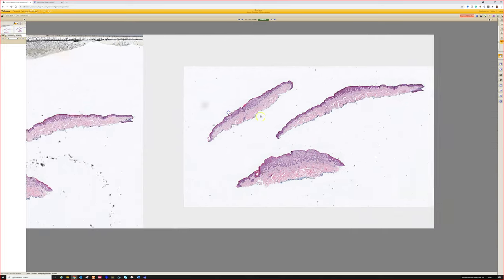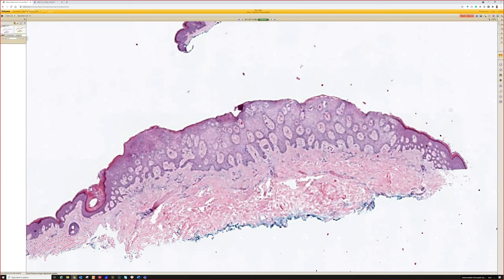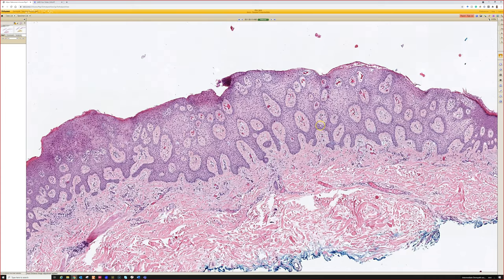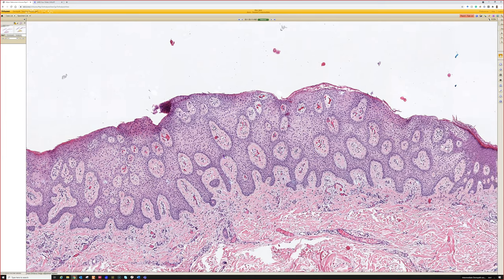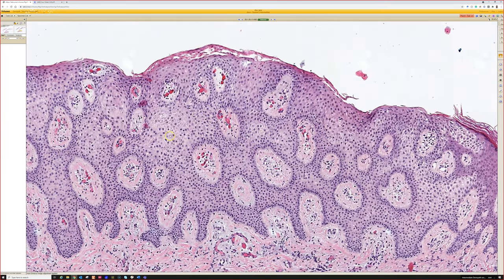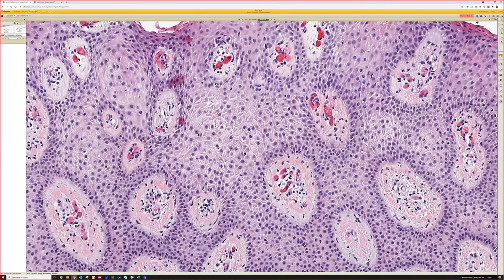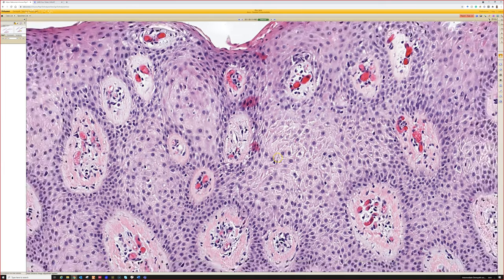Okay, this is case 11. Yeah, clear cell acanthoma. Even from low power, even when it's not in focus yet, you can tell it's acanthotic epidermis. Not really clear usually, but more pale. Some people like to call it pale cell acanthoma, because the cytoplasm is kind of a pale pink, and also there's a spongiosis in between usually. So it's a mixture of pale cytoplasm plus intercellular edema between the cells, or spongiosis.